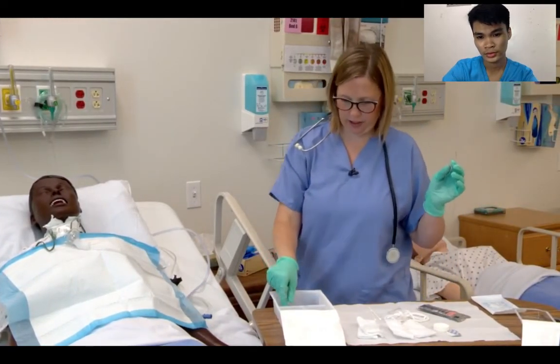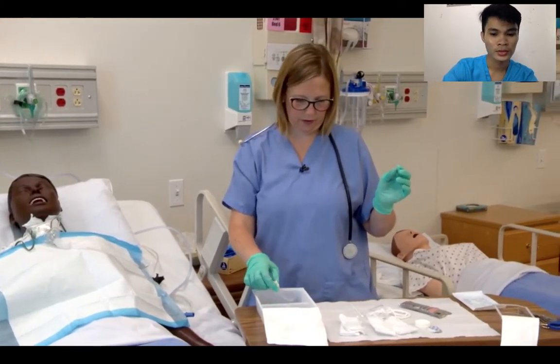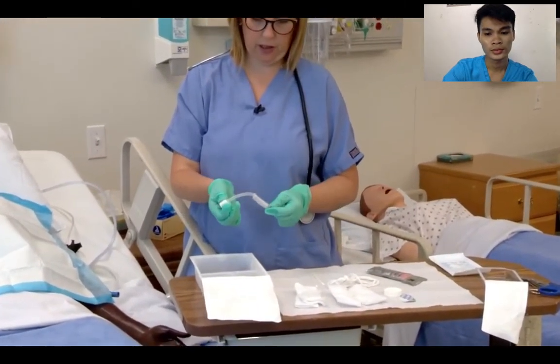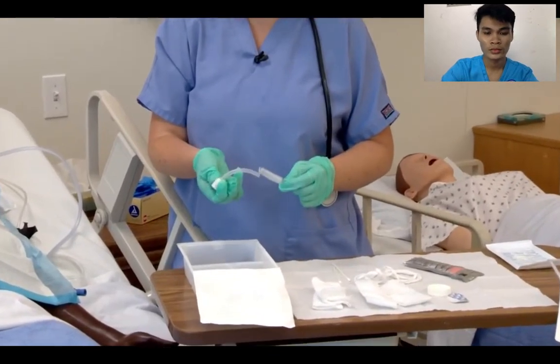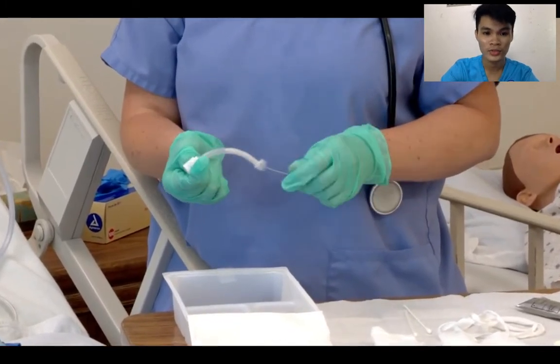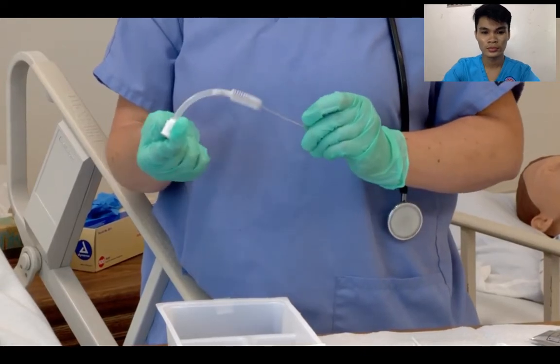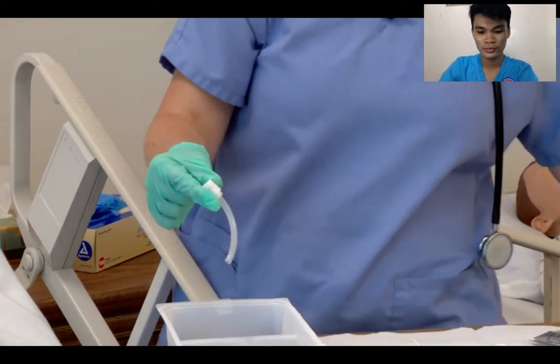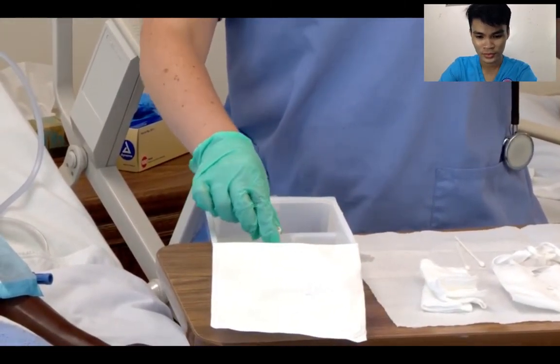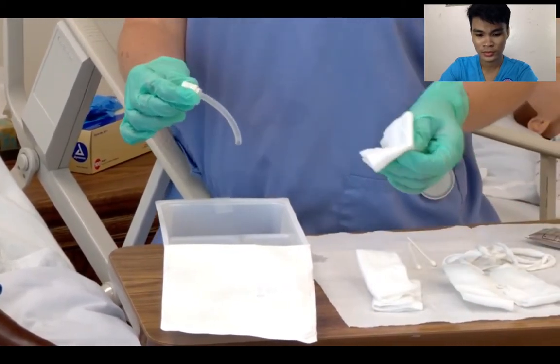Now I'm going to clean the inner cannula. So remember, it's sitting here in the 50-50 solution. We're going to take the pipe cleaner and we're going to get all this gunk out of the inner cannula here. Make sure your clean hand is the one holding on to the top part of the inner cannula. Okay. Good. Now we're going to rinse it in the other saline solution. Good. And then we want to make sure it's dry because remember, this is going back into the patient's airway.